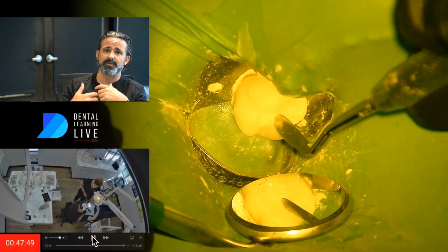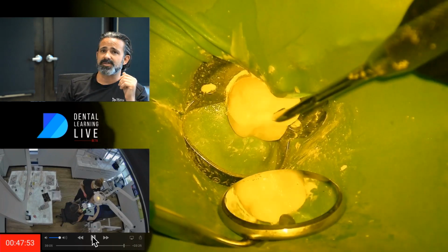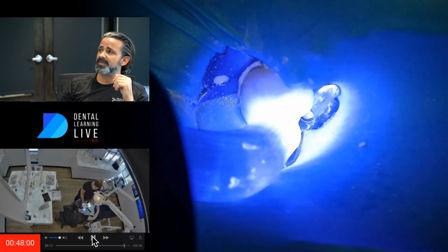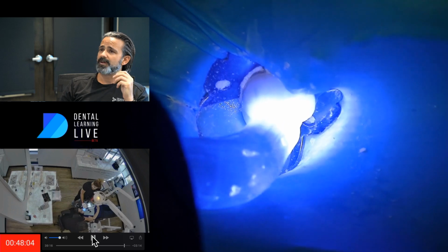Some guys overbuild and prep down, but that's my preference. So I don't feel like I need to polish things up from the grit of my diamond. And then we'll do our final light cure here.